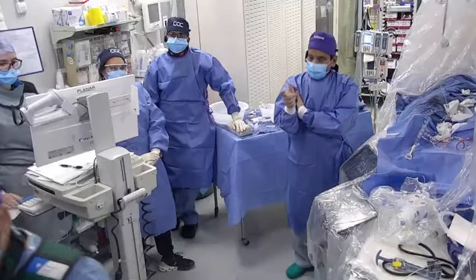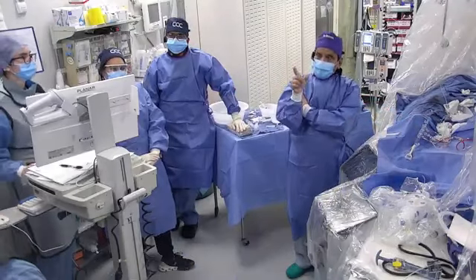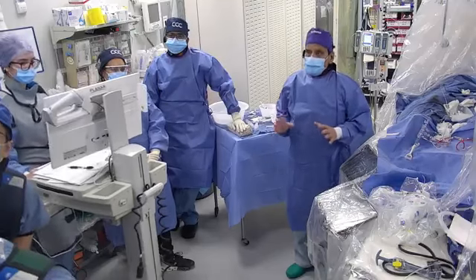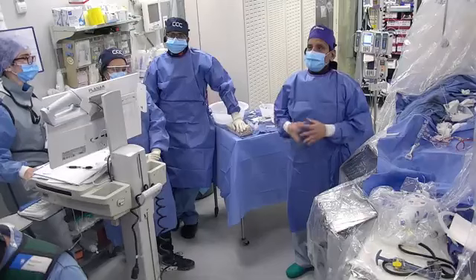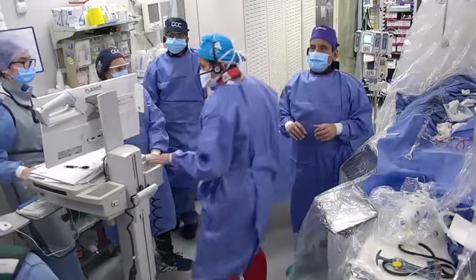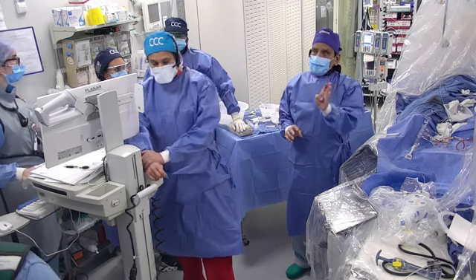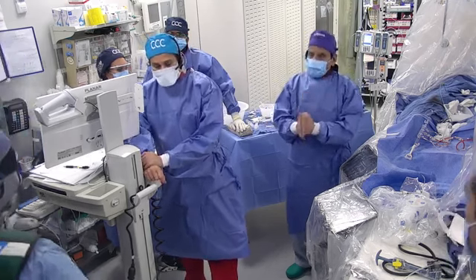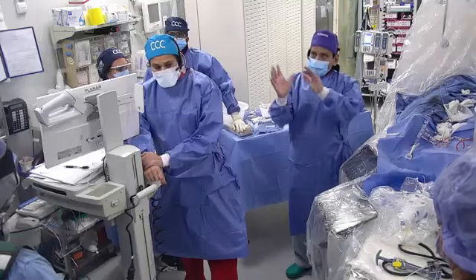One of the reasons was that in some cases in Eclipse, they went to 120,000 RPM. To me, they should eliminate that, and I'm working with Abbott now on eliminating the 120,000 RPM speed. They should be 40, 60 and 80. You don't need beyond that. It is a very effective device, it causes deep cuts, and therefore go down on speed.